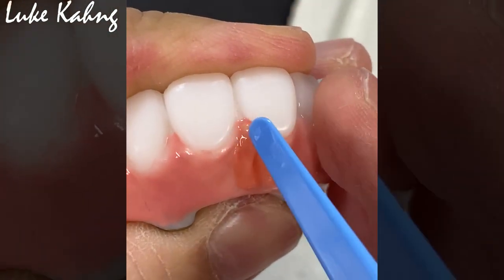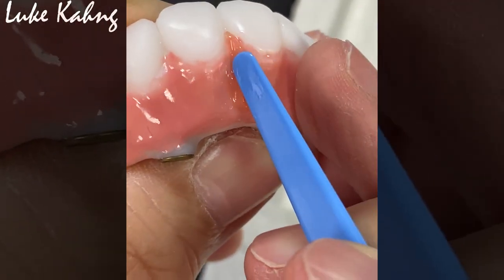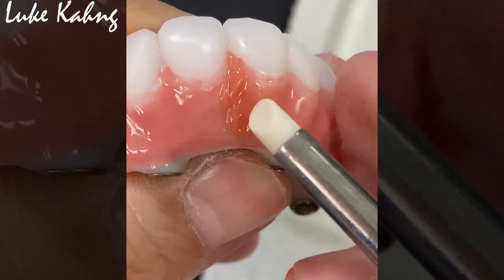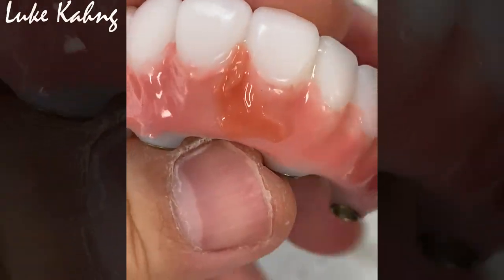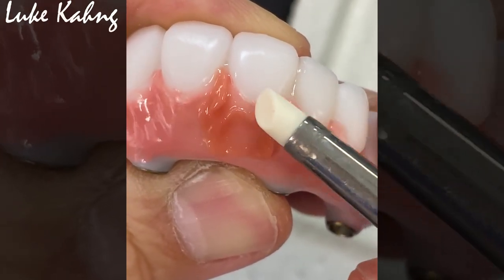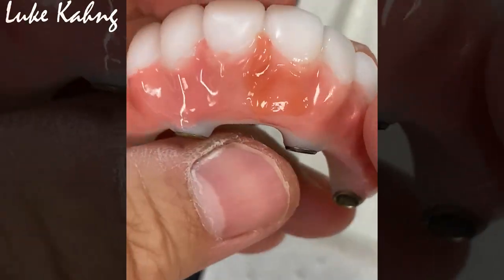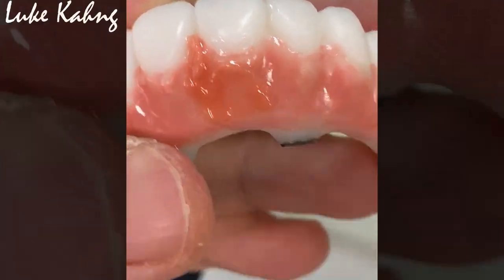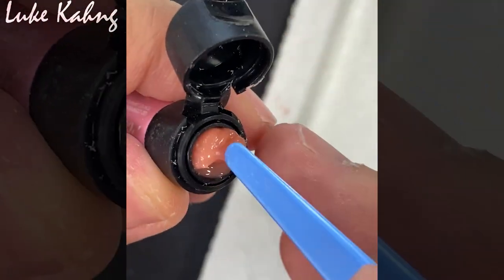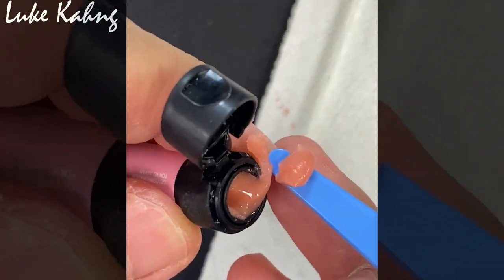Now I apply the composite on top of the stain area, paste area, so I get the better aesthetic, minimize my labor. So just make sure this one, let's go. And also you can use the more Gradia composite. It's more, you can take it out. That's fine.